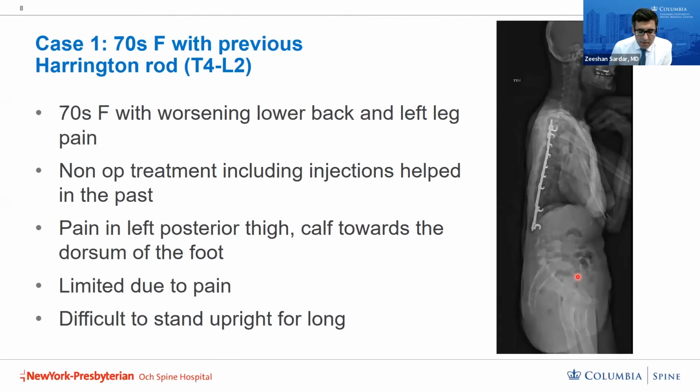So I thought I would present a few cases of patients with Harrington rods that I had to do revision surgery on, to go over some of the key concepts that I look at when we revise these patients.